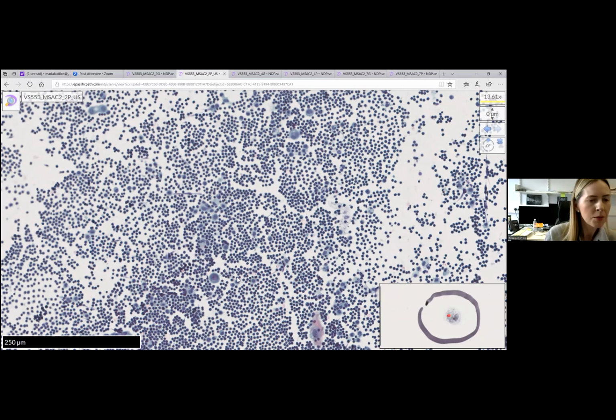I think the important note to make of these sort of examples is that you don't want to exhaust the material by doing a 20 immunopanel. And I think it's very important to be quite targeted and directed, because a lot of our material now is required for ancillary molecular testing. So in the case of a breast carcinoma, you'd want to be able to perform ER, PR, and HER2, because often these are required for oncologists to guide treatment.